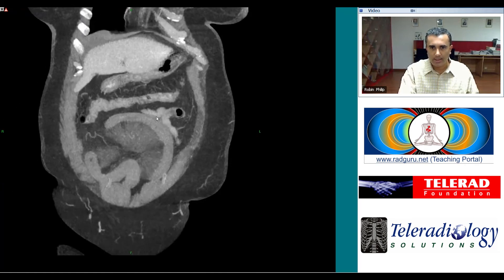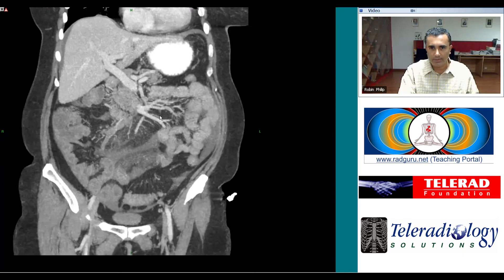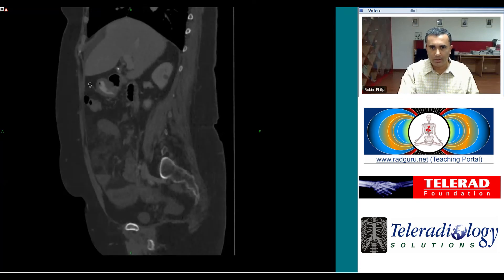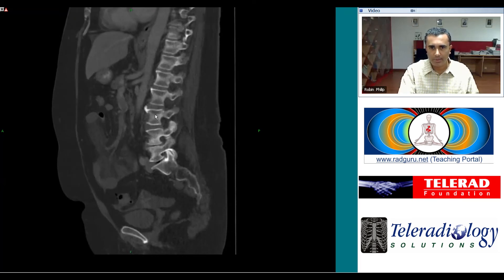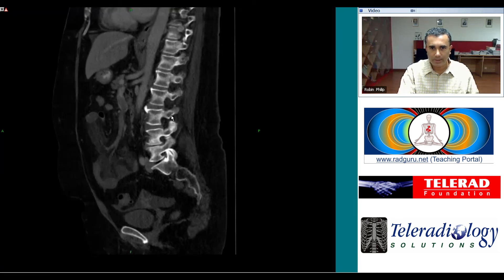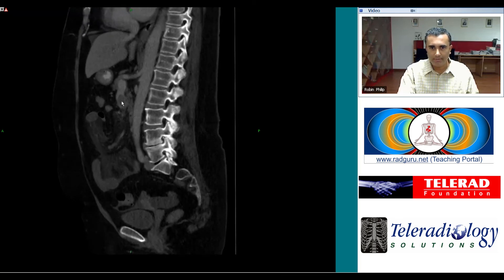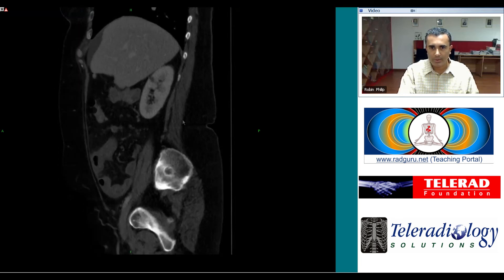The finding is nicely seen on the reformats as well. These are the coronal views — you can see the filling defect very clearly here within the superior mesenteric vein. Sometimes the reformats are helpful; as you can see, the finding is much more striking on the reformats than it was on the axials, where one is liable to scroll through it.